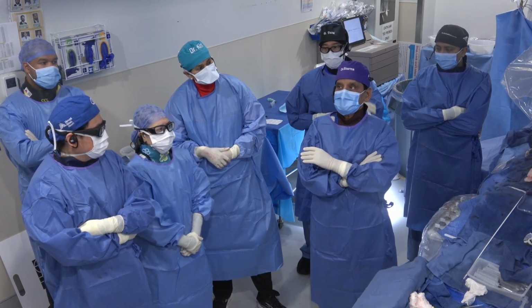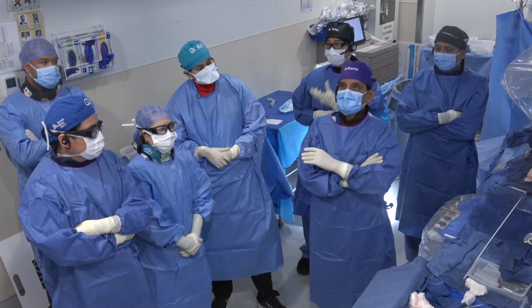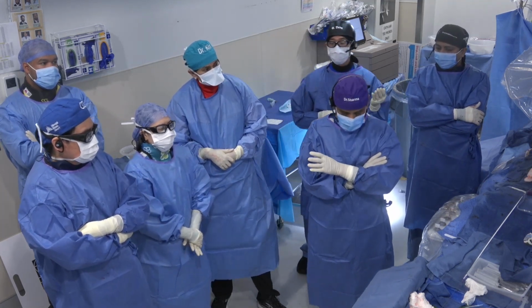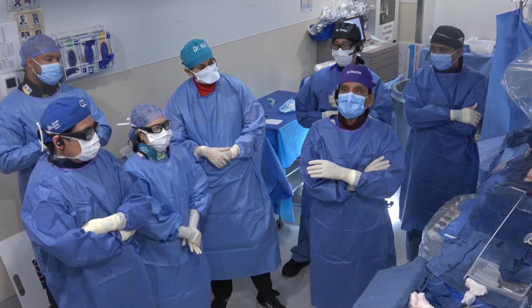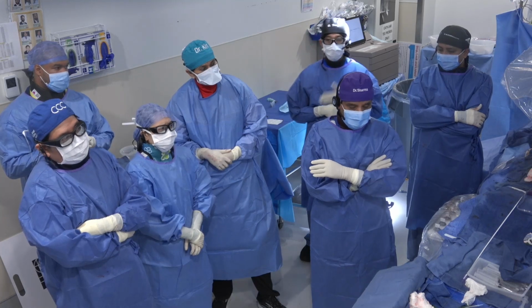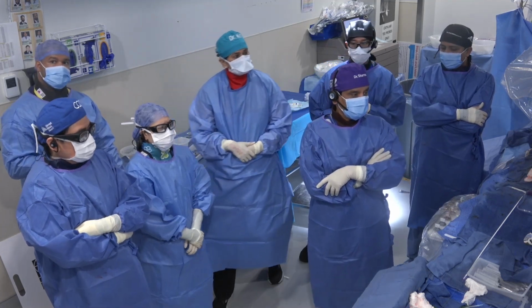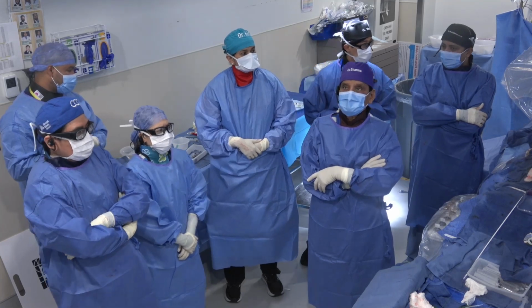That's where pre versus post fracture comes in, because if you pick a larger valve, then you have a bigger mismatch and you might have trouble implanting at the right depth. You might implant too high, and then you cannot fracture afterwards. So if you tend to fracture afterwards, implant a little deeper because it's going to foreshorten from the base. If you fracture before, you have less of that issue. But to your point that you might have acute AR, we always have the valve ready to go. When we deploy, we deploy very quickly, at least up to the functional aspect of the self-expanding valve, Evolut or Navitor, so that you take care of the AI first. If you need to, you can always recapture and reposition.